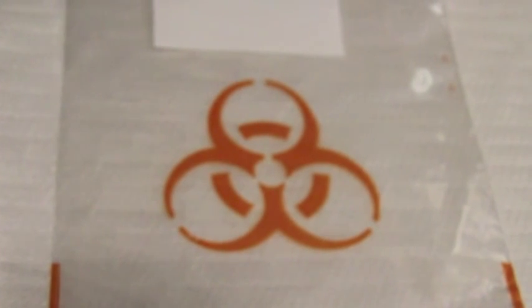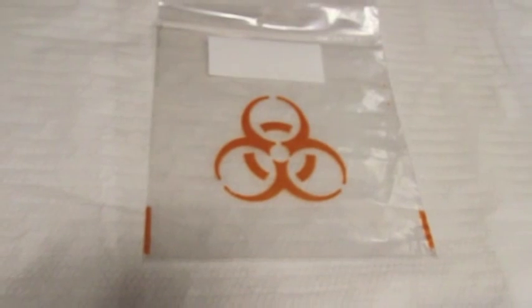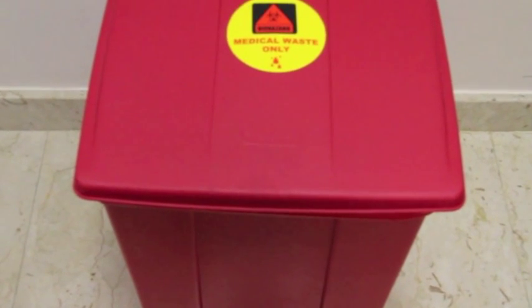This is a plastic biohazard bag used for transportation of samples. The red waste bin is used to dispose of contaminated or biohazardous waste. This container is specially designed for disposal of used, sharp objects, such as needles.